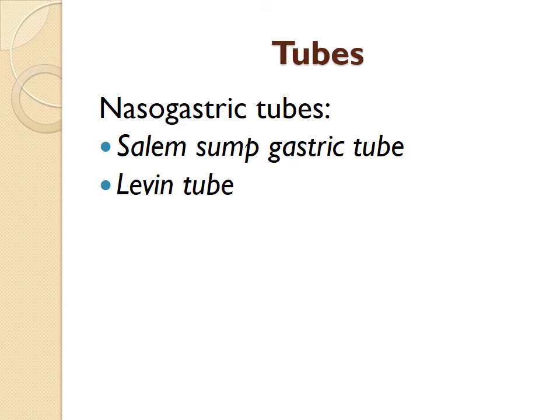They are, as I said before, temporary, and they usually vary in size depending upon the size of the GI canal. I will have some different tubes out there in the classroom for you to check out. They are single lumen, therefore they cannot really be used to decompress or to connect them to suction. And we'll talk about the reason why that doesn't work that well with them. And as I said before, they're usually just used to give administration of meds and food.